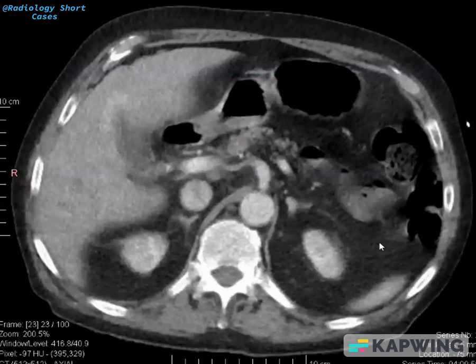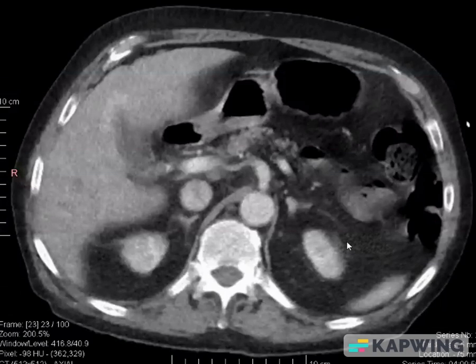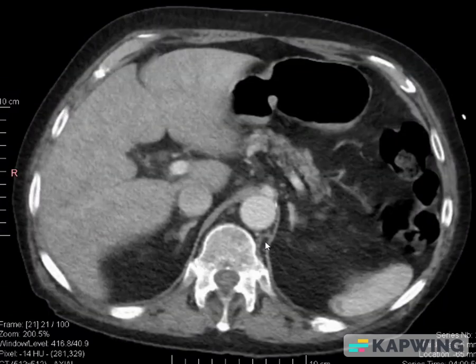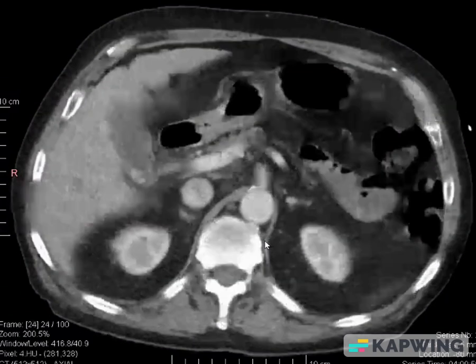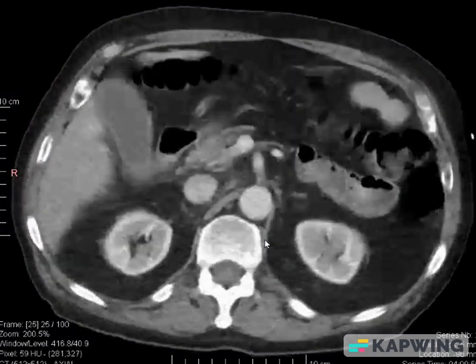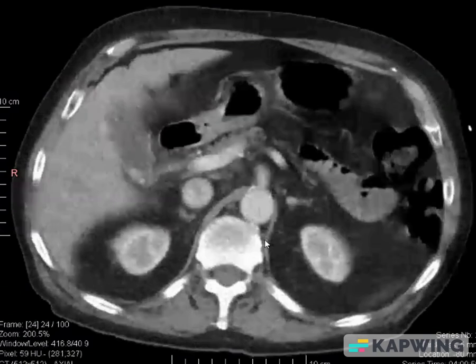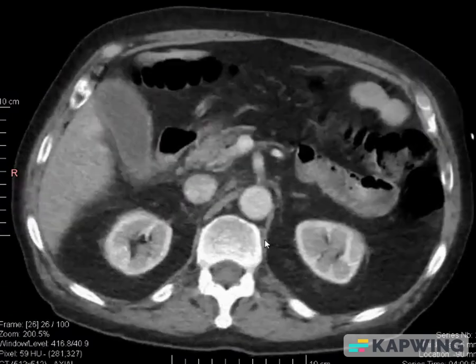Hello friends, welcome back to Radiology Short Cases. Today we have an interesting case of CT abdomen. This is a contrast and non-contrast CT — I am going to scroll the images. What do you see here?